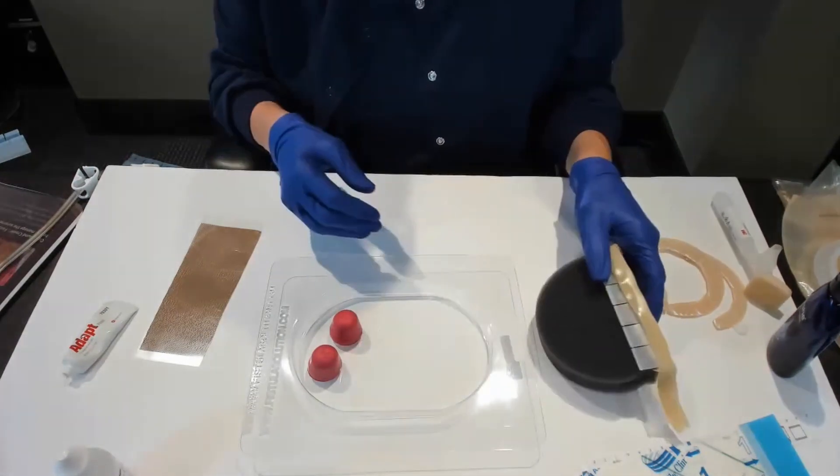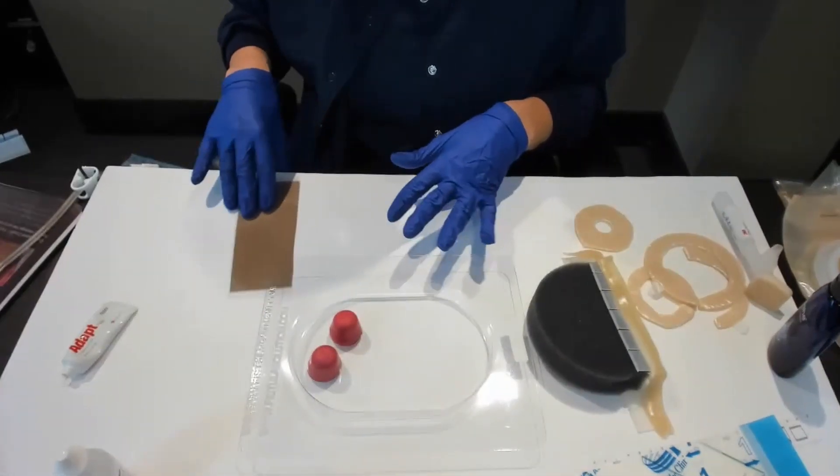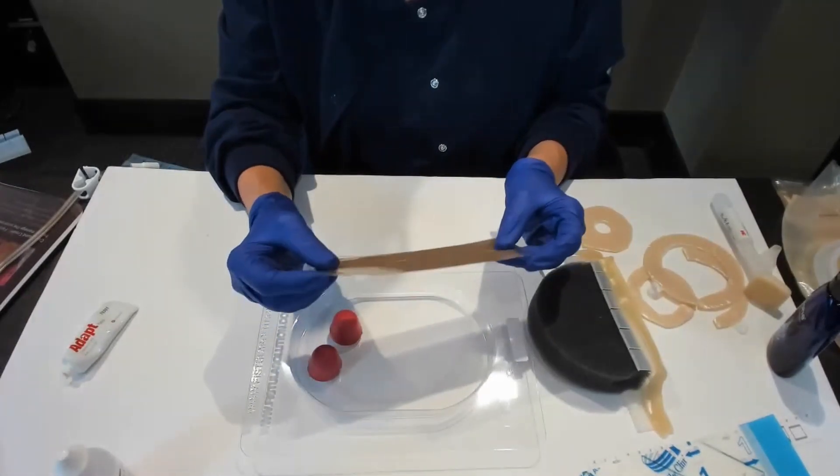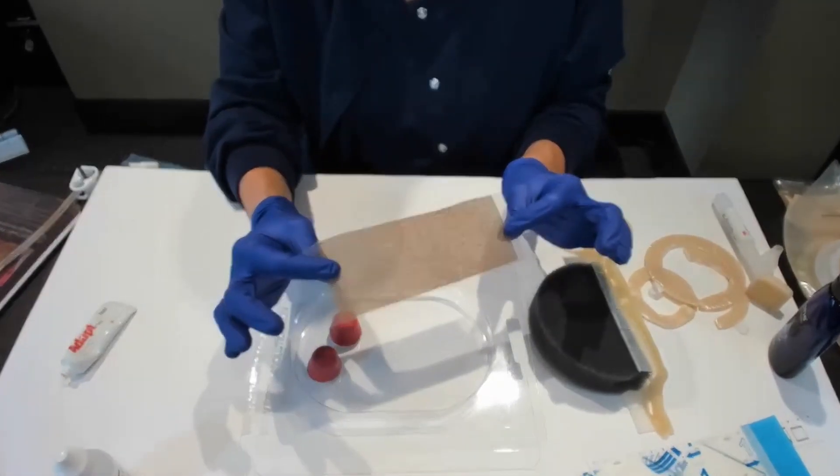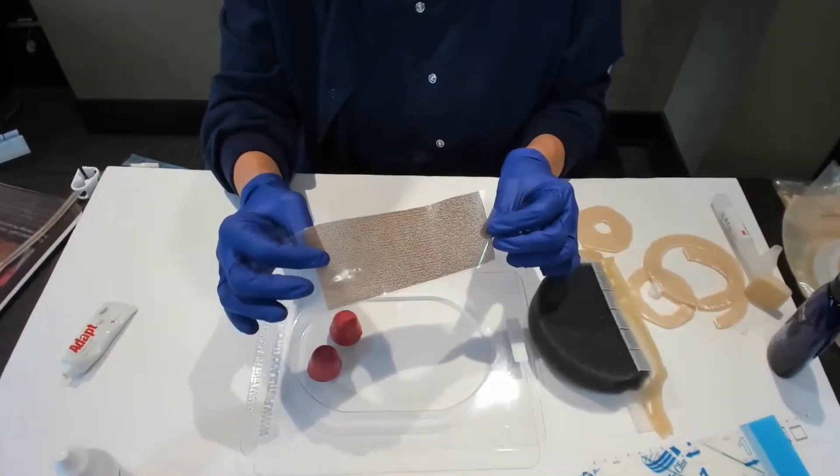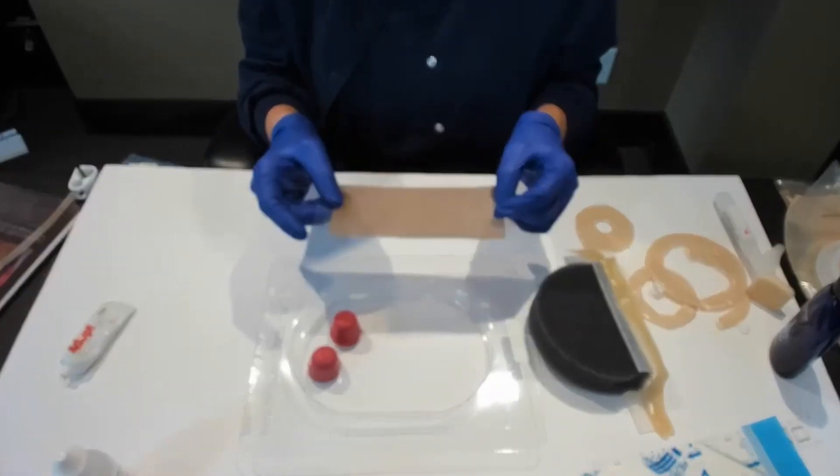Then in a real patient, sometimes I'll use a non-adherent contact. Like this is Ergotool, Mepitel 1, Adaptic Touch.